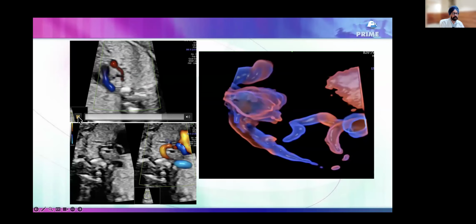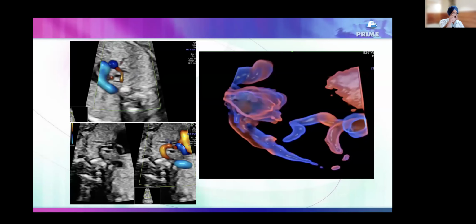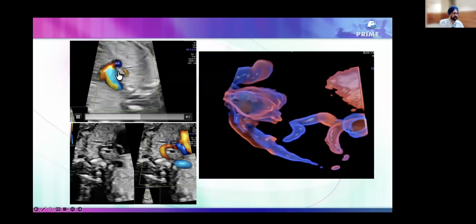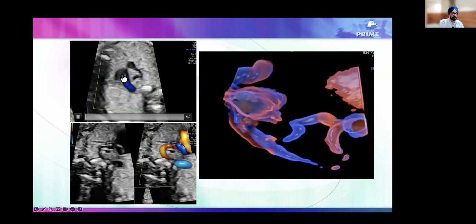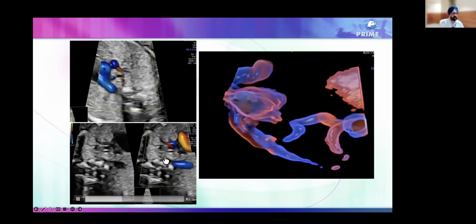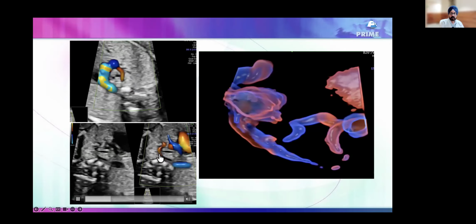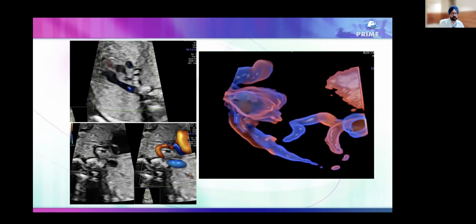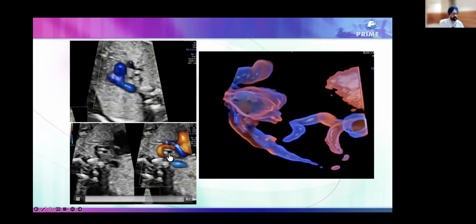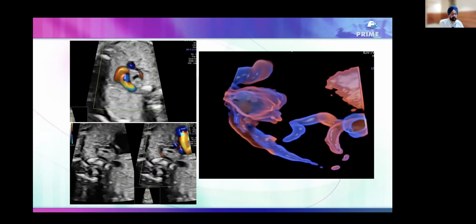Your eyes should be trained to see venous flow, with the two pulsatilities in the vein, single pulsatility in the artery. You can see the single pulsatility in the artery, and you see a little stay in the vein, right? So this is an azygos vein. Many people call it the azygos arch. That's the third arch, right? Aortic, ductal, and azygos arch is just the name. Azygos is not going to become happy about it, but that's okay. We just don't need to name it.